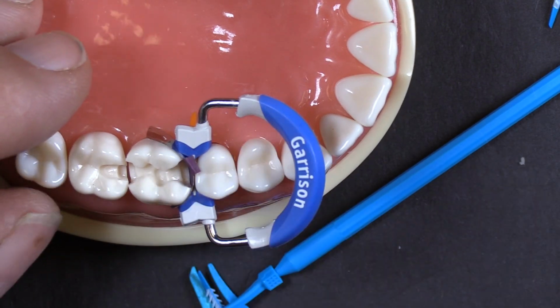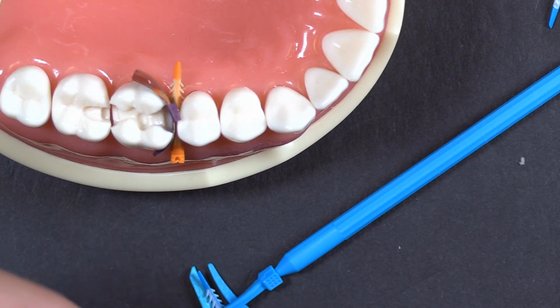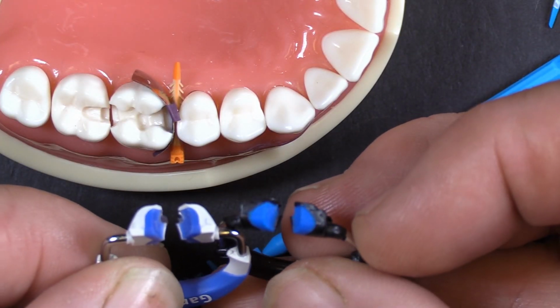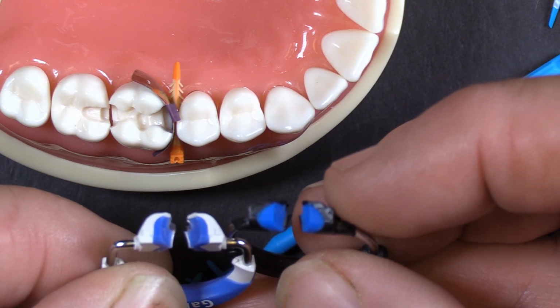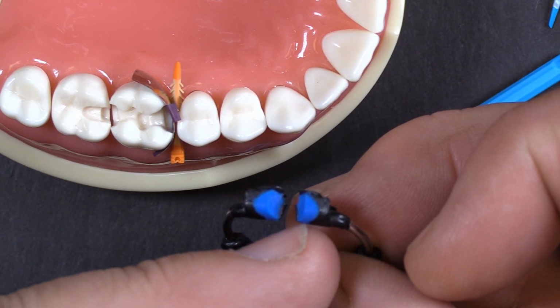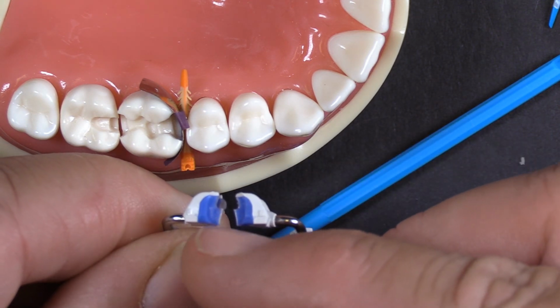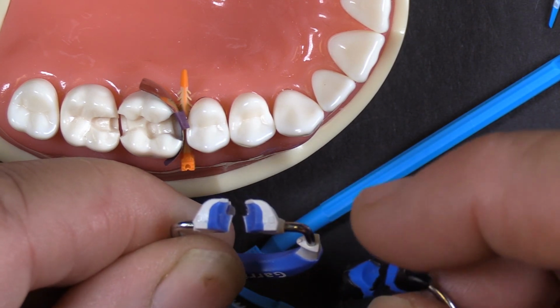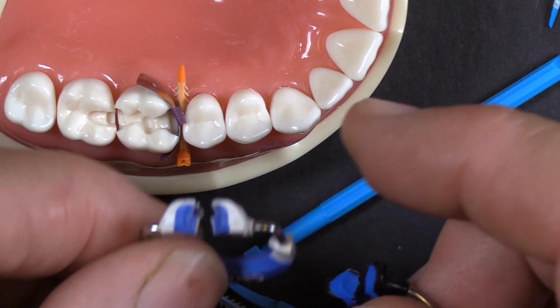The new fusion rings have a little extra curvature at the top. I don't know if we can even see that on the camera here. The rubber pad on here has a different geometry than the prior. Oh, you can see that. Yeah, you can see this, the one on the right, the black plastic one, how that pad comes very straight up. And then on this one, you can see how the pad has got much more anatomy to it, so it helps to maintain the curvature towards the occlusal margin of that matrix band. So it's a little bit of a plus.